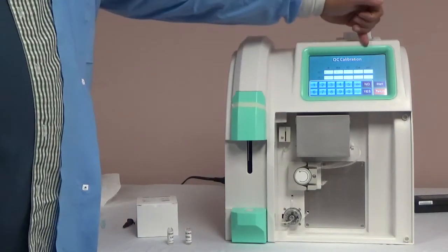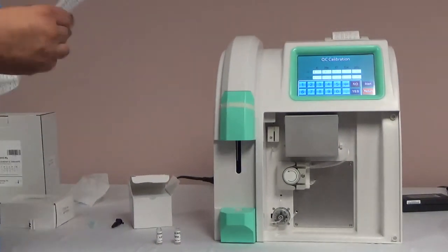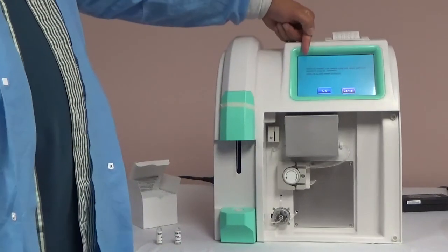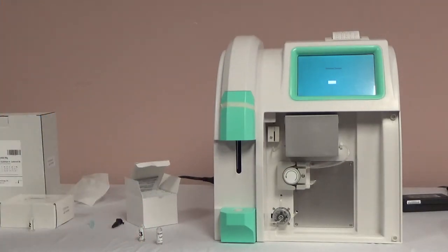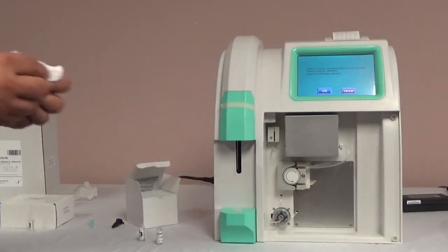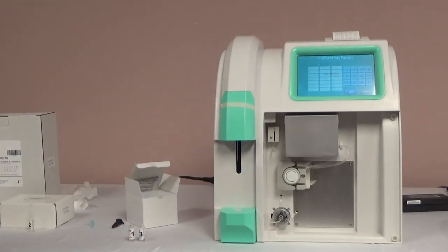You will set the targets for QC calibration, which can be found on the insert sheet of the product. For each level of QC, find the analyzer and the level that you will be testing, enter the target and the range, hit start, and begin the calibration. The instructions on the screen will tell you to insert QC level 3. Slide the bottle onto the probe, press OK, then remove it. The analyzer will test the sample and calculate the factor for the high control. The analyzer will then prompt to enter the second QC level, level 1. It is best to wipe the probe with a lint-free cloth in between samples. After level 1 is aspirated, the analyzer calculates the factor, and you can review the factors to make sure they look accurate. If they look off, you can hit cancel and rerun calibration. If the factors are accurate, hit OK.